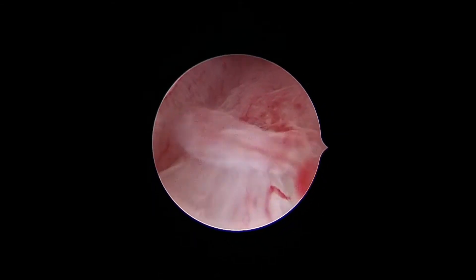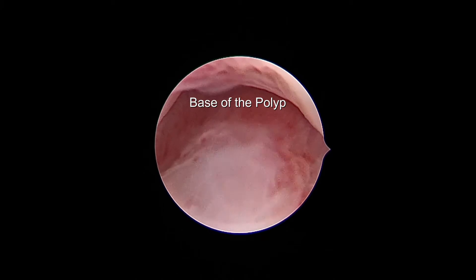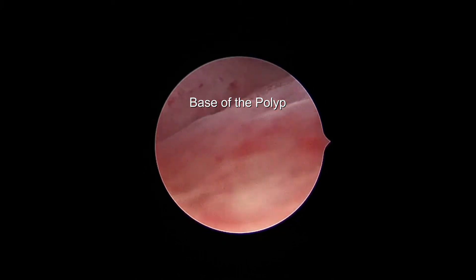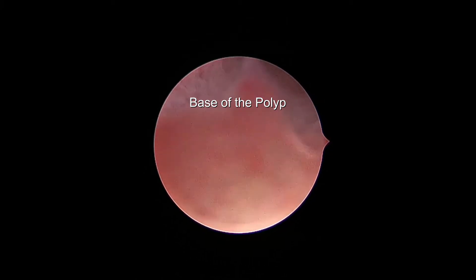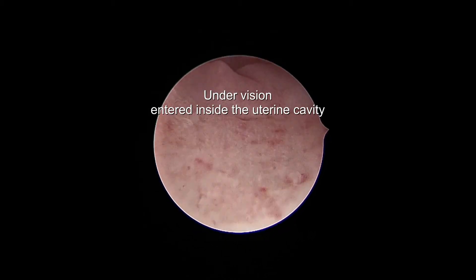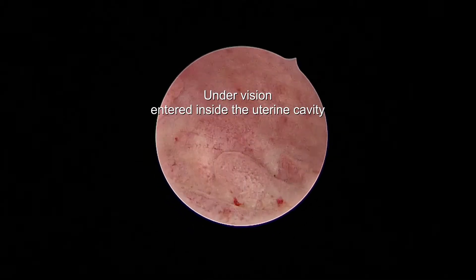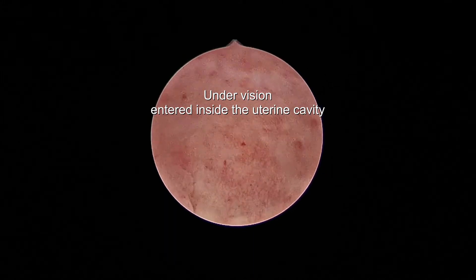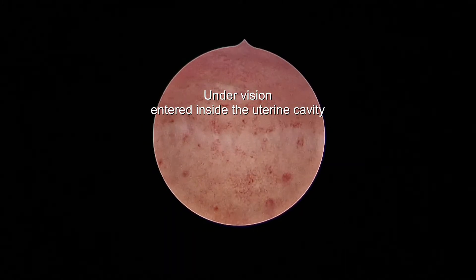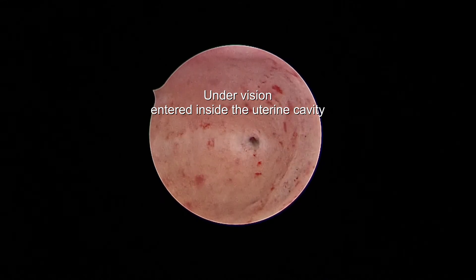You can appreciate the polyp base here, coming from the posterior cervical part just near the isthmus. When you move the scope you can enter inside the cavity. This is the atraumatic approach — you don't need to dilate anything at this stage, otherwise it will distort the view.